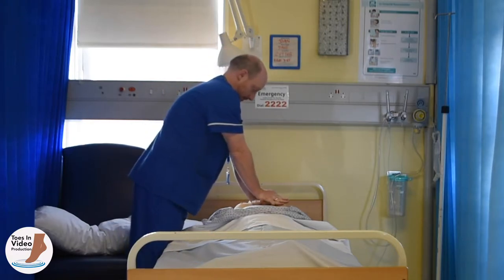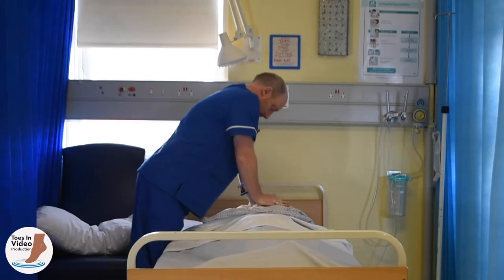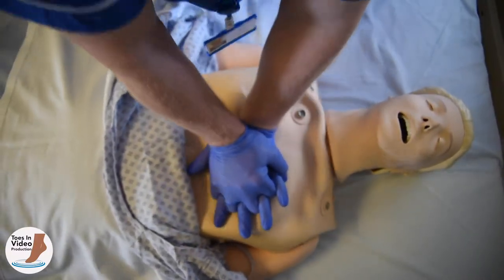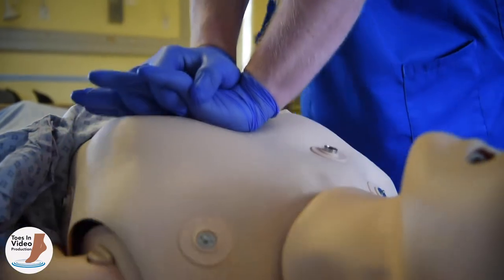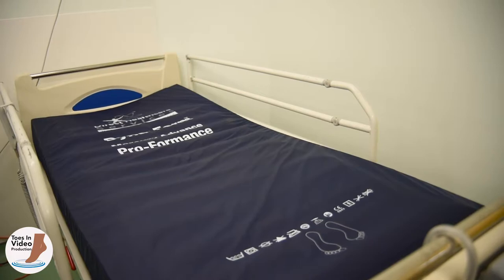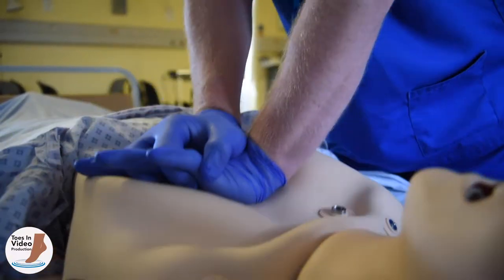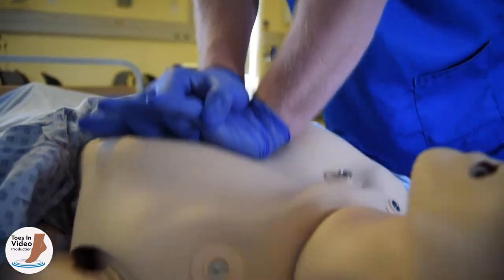Deliver chest compressions at a rate of 100 to 120 a minute, roughly two a second. Compress the adult chest to a depth of five to six centimetres, allowing the chest to recoil naturally between compressions to maximise efficiency. Do not allow your hands to leave the patient's chest while delivering compressions. Give 30 effective chest compressions. If the patient is on an airwave or any other pressure relieving mattress, ensure the emergency deflating toggle is pulled and begin CPR while it is deflating, as a delay in beginning CPR while the mattress deflates will adversely affect the patient's chances of survival.